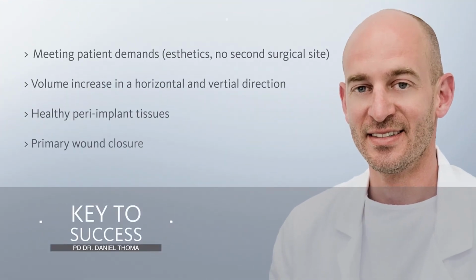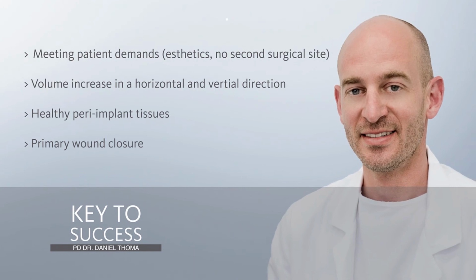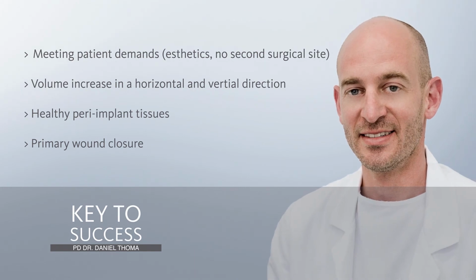The current clinical case demonstrates a clinical benefit in terms of aesthetics, applying a collagen matrix to augment the soft tissues following implant placement. The use of a soft tissue substitute reduced the treatment time and resulted in a decreased patient morbidity as well as an excellent clinical and aesthetic outcome.